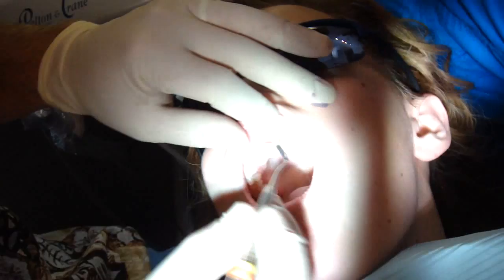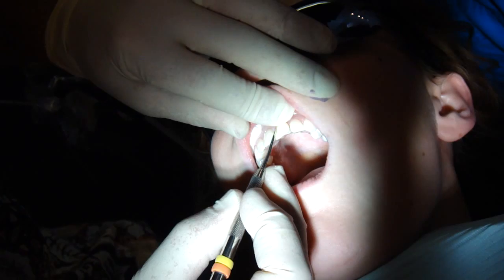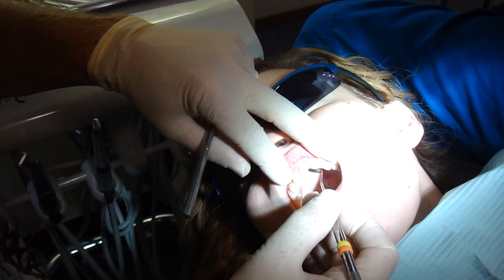We've taken the impression, and now I'm just making temporaries so that you'll look good. In fact, this is exactly how the mock-up was done that we did when we were deciding whether to do veneers or not — so this is the temporary veneer, and it'll last you for a couple of weeks, and I just kind of hand make it.